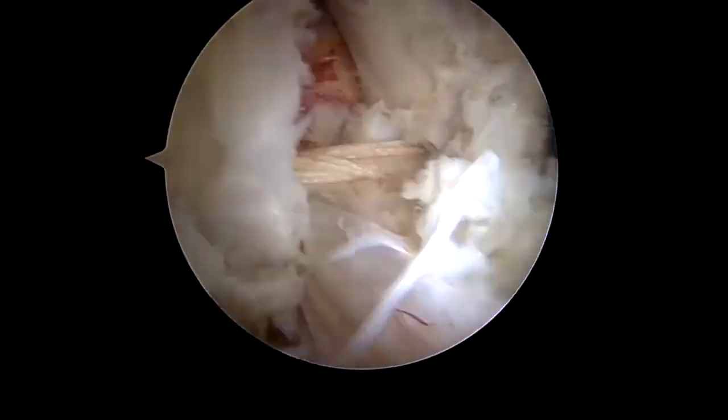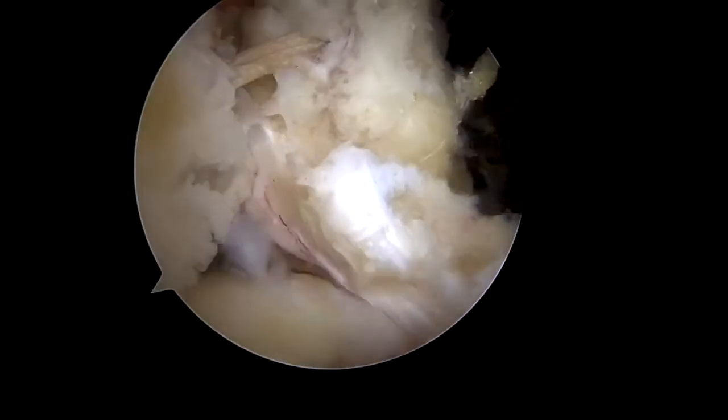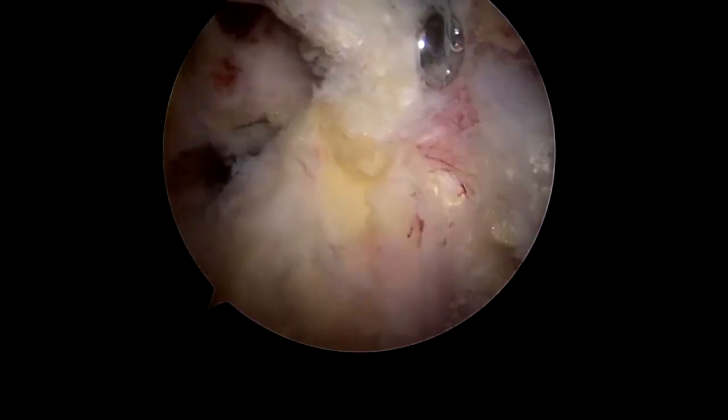The degree of coracoid transfer is assessed progressively throughout tensioning whilst the arm is rotated, assessing for subscapularis excursion. Once the coracoid transfer is completed, we can see the sling effect created by the conjoint tendon.